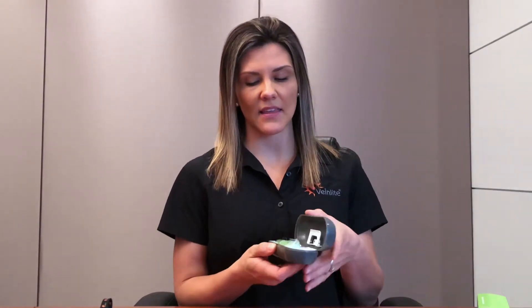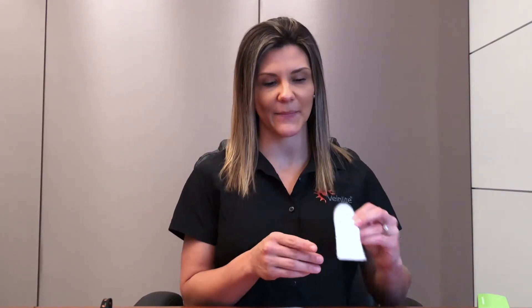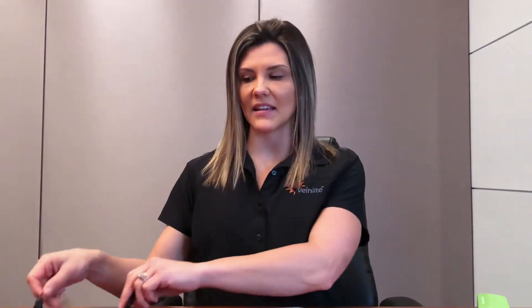Once you open your case, you will see that the Veinlight Neo comes with a AAA battery that powers the unit, the Neo itself, a protective end cap that doubles as a lanyard holder, and a pack of disposable plastic covers which will protect your Veinlight Neo and prevent cross-contamination between patients. You may also purchase a lanyard as an accessory.